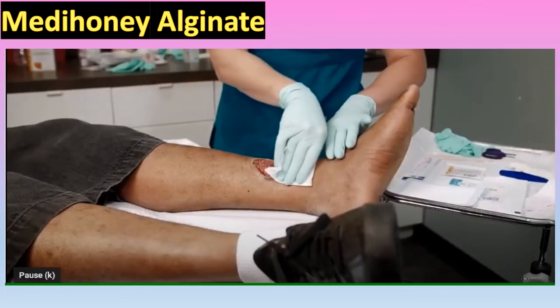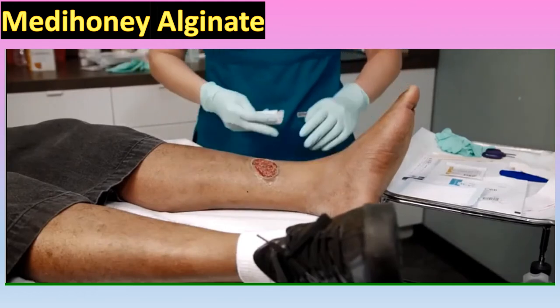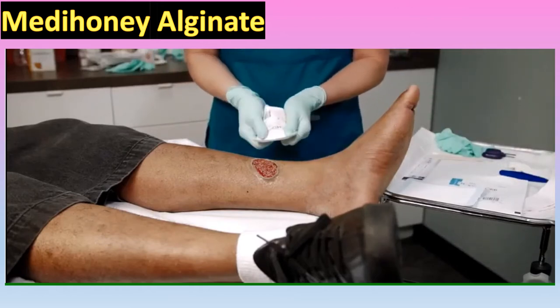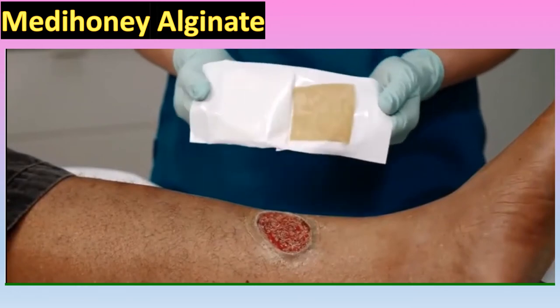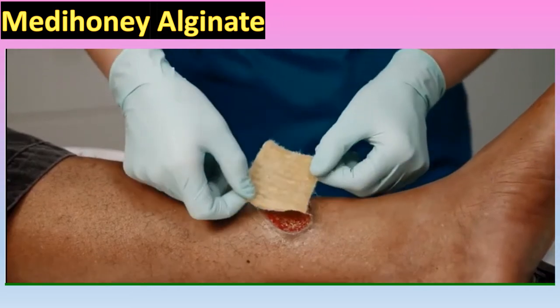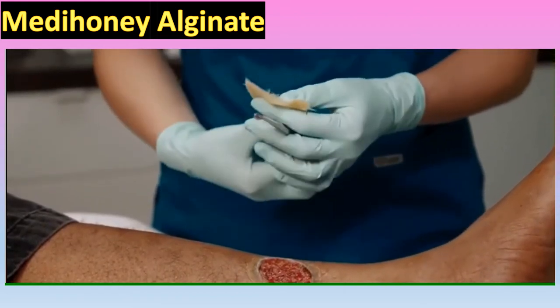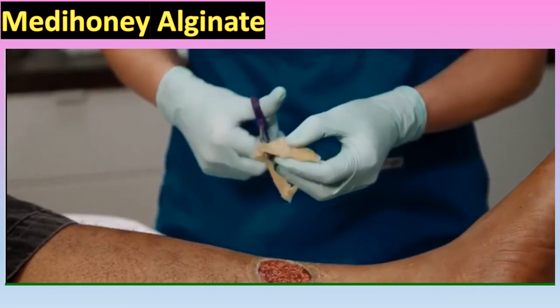Now we're going to see the demonstration of how to use the different types of Medihoney. After cleaning and preparing the wound by applying a protective skin barrier to the peri-wound, we are ready to apply Medihoney Calcium Alginate to this venous leg ulcer. Before opening the dressing, fold the dressing back and forth in both directions to make it soft and pliable. Then firmly pull apart the two end flaps and remove the Medihoney Calcium Alginate. Before cutting, assess the correct size needed for the wound, as you want the product to be completely inside the wound edges and not overlapping onto healthy peri-wound skin. Then cut the dressing to the approximate size needed.